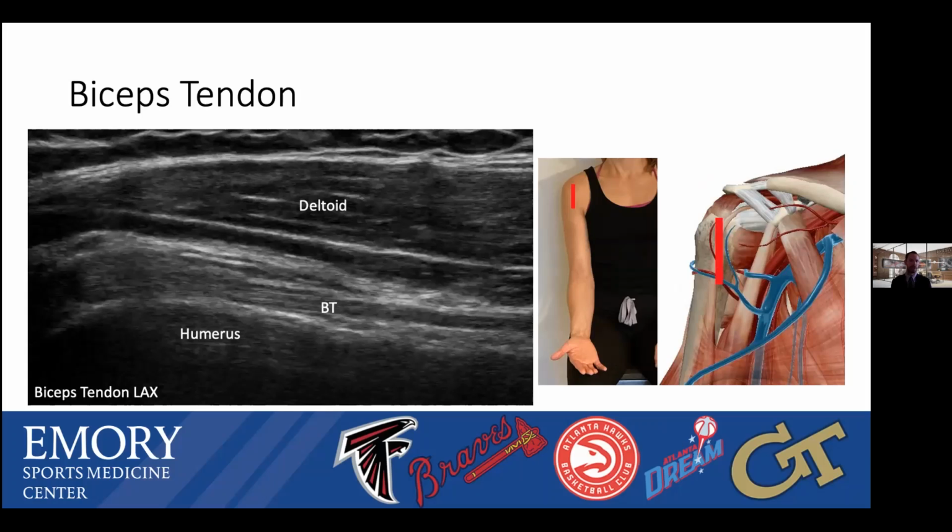So we still have the patient's hand kind of supinated, sitting on their leg or their thigh. And now we can go into long axis image, and you could assess with sonopalpation to see if that reproduces their symptoms. You can turn on Doppler as well, looking for hyperemia. Again, this was normal within this patient.